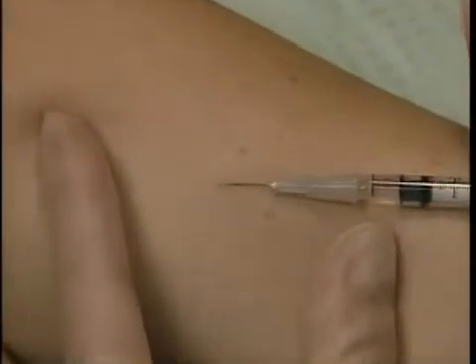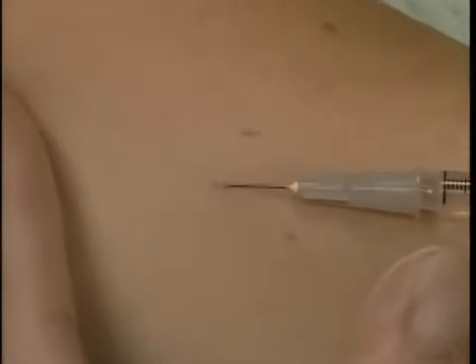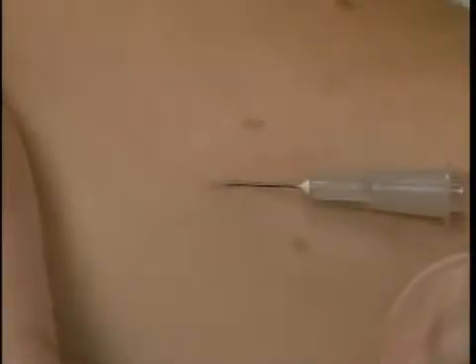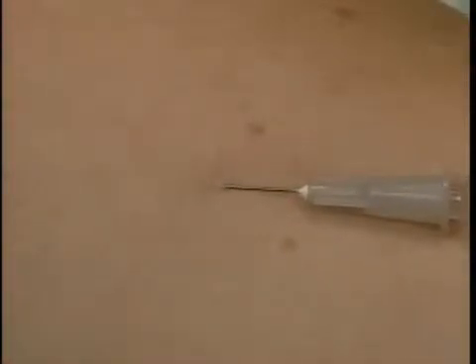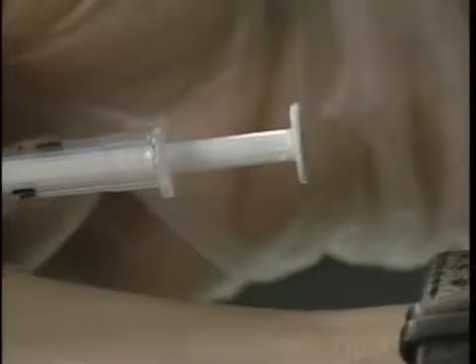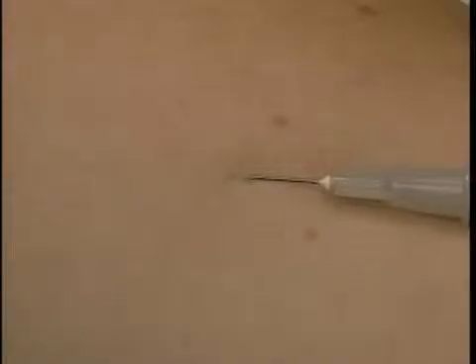When the needle is inserted at the correct angle, you can see the bevel of the needle just below the skin surface. Next, release the stretched skin and hold the syringe in place on the forearm. Grip the flange of the syringe between your first and middle fingers. Use your thumb to press on the plunger. Now, slowly inject the tuberculin solution. You should feel fairly firm resistance as the tuberculin enters the skin. A tense pale wheal that's 6 to 10 millimeters in diameter appears over the needle bevel.